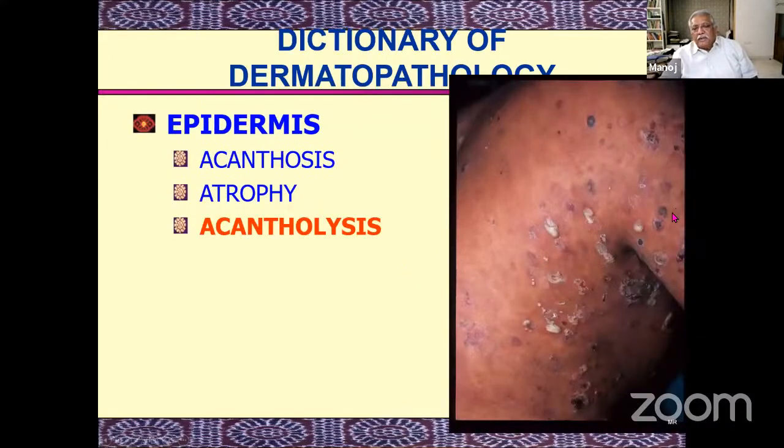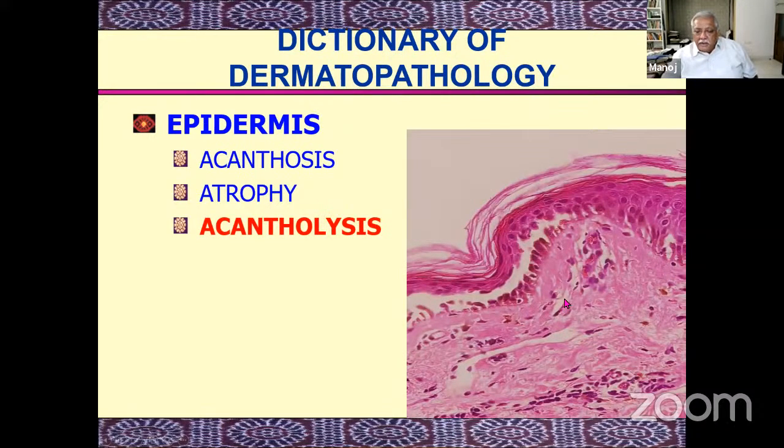Now, the other thing which can happen in epidermal cells, apart from acanthosis, is acantholysis. You saw that slide of spongiosis, right? Now, when that spongiosis is extreme, then the cells will come apart. And that extreme spongiosis is caused by 2 or 3 major events. One is where the desmosomes themselves are separated from each other, right? So you have here, desmosomes are gone. The lowermost area of the epidermis, which is the basal layer, is attached because the attachment here is different. Here, for some reason, the desmosomes have dissolved.